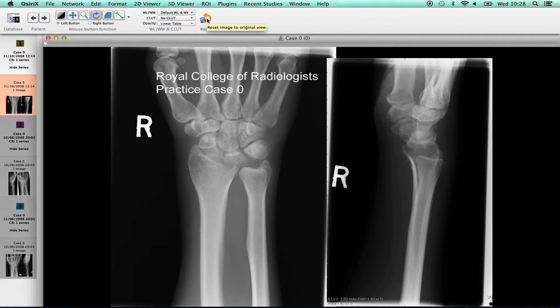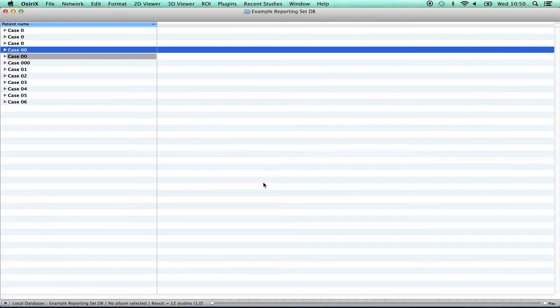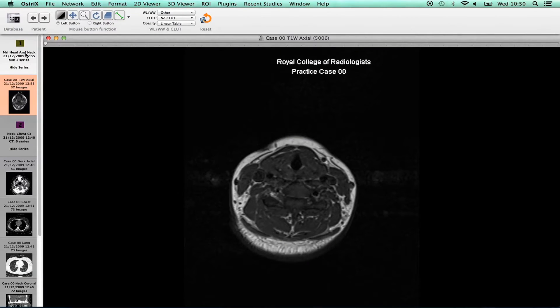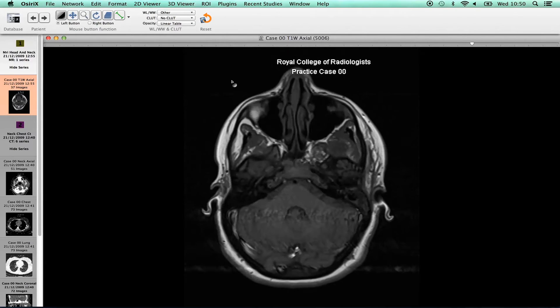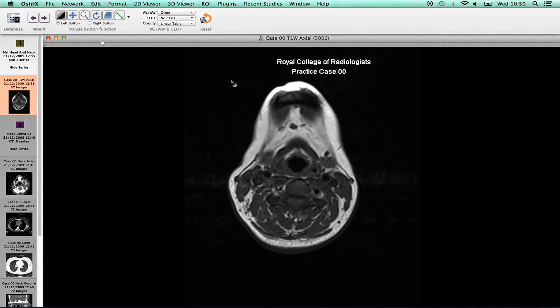Cases which contain CTs, MRIs, mammograms, ultrasound scans, fluoroscopy, cystograms or MRCP examinations must be scrolled through in order that the whole series can be viewed, as these scans are not single images. The case description for Practice Case 00 tells us that this case is a T1 weighted axial MRI scan. MRI scans are viewed by scrolling through the MRI dataset. There are two different ways to do this. The easiest is to use the wheel on the mouse to scroll through the images, which stops when you reach the end of the series.